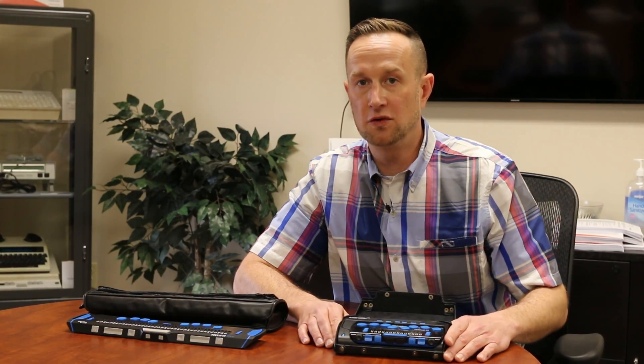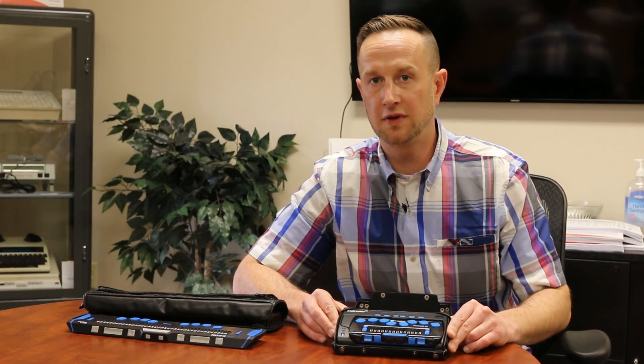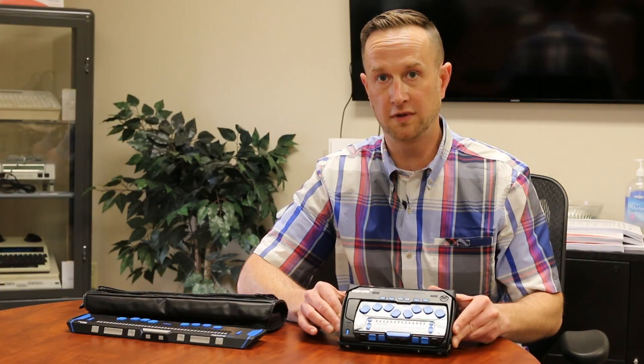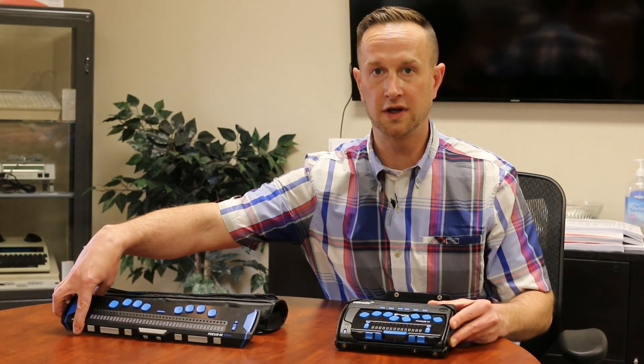Hi, I'm Greg Blackman with I Can See, and I'm here today to talk about a few really cool devices from Freedom Scientific — some Braille displays and some note taker docking stations: the L Braille 14 for the Focus 14 Braille display, and I also have with me the new Focus 40 Braille display as well.